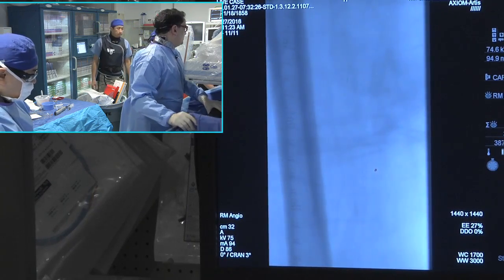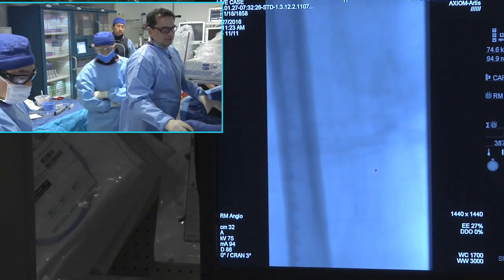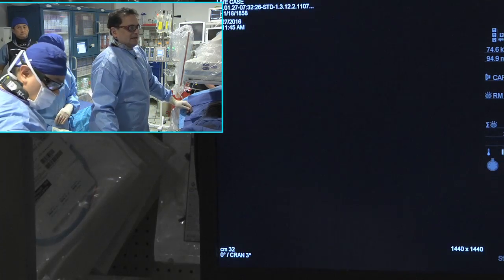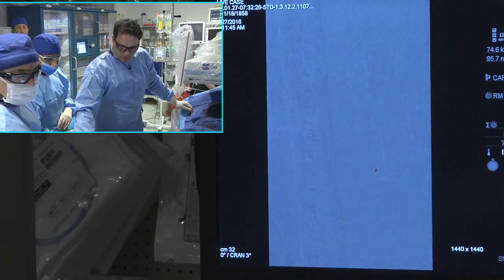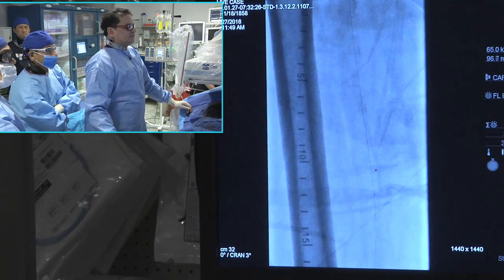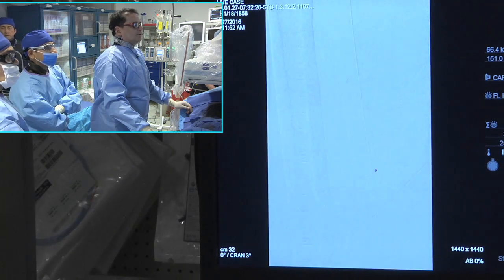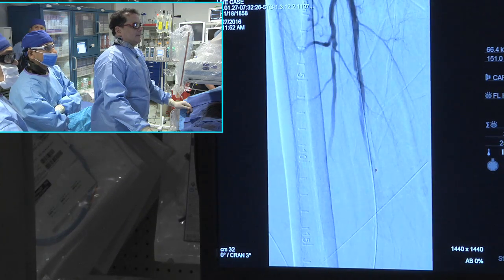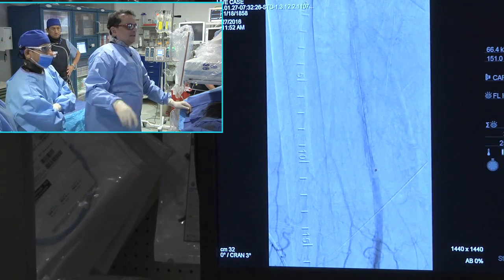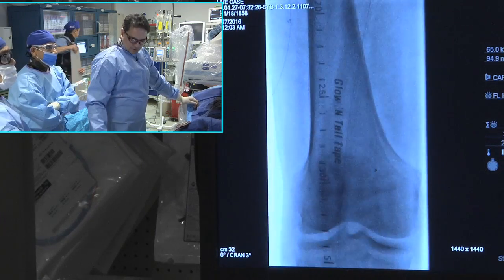Okay, Mehar? Okay. So Vishal, let me take a final shot here, since the patient is having issues with sedation. What we'll do is we'll show you what it is now, and then next month we'll show you our final result to let you know how it did turn out. I want to show you that we've now opened the SFA. We're going to stent that mid lesion there, and likely the ostium. Likely, I'm not certain. I may do a prolonged balloon, see how that turns out. I want to show you the distal runoff.